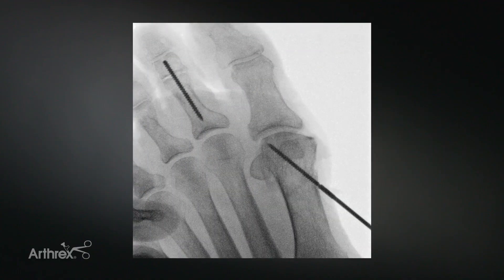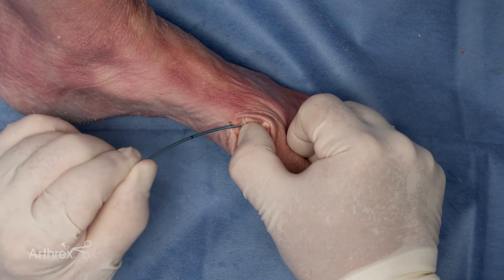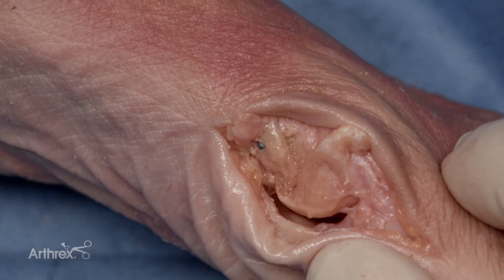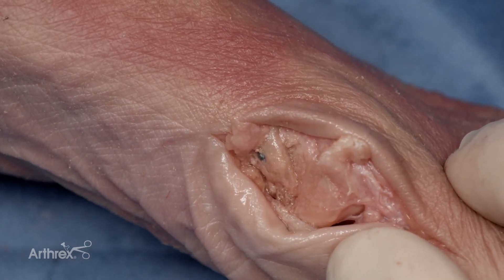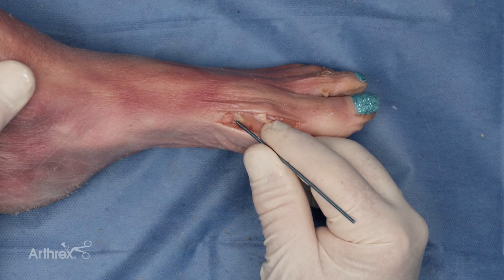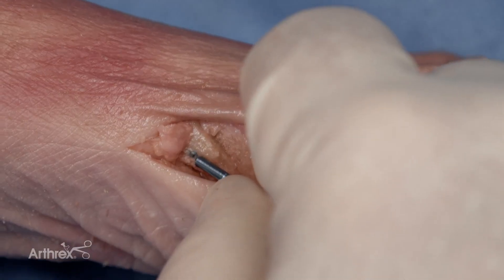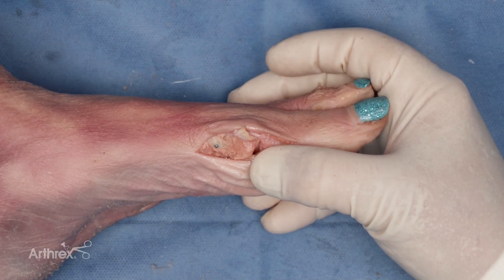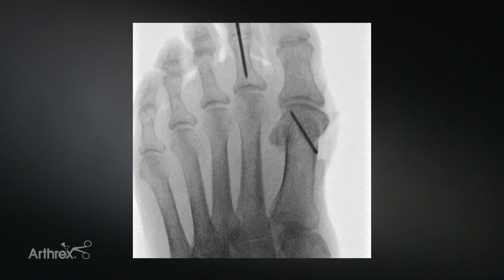Prior to snapping off the pin, it is advisable that a radiograph be obtained. The pin is now snapped off. The residual medial eminence can now be removed. When snapping off the pin, it is advisable to move the pin in just one plane rather than toggling it back and forth. Also, providing a fulcrum at the base can be advantageous. The snap-off pin provides a headless, low-profile compressive fixation for osteotomies such as a distal chevron.